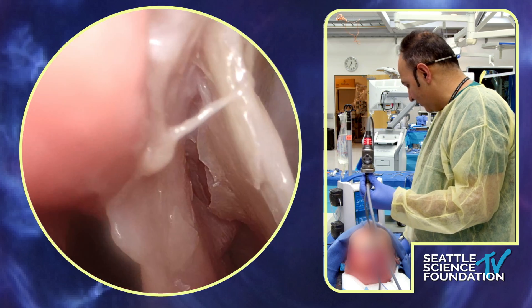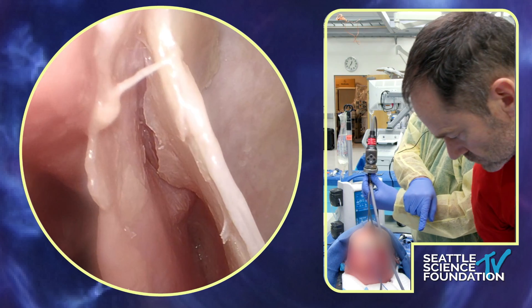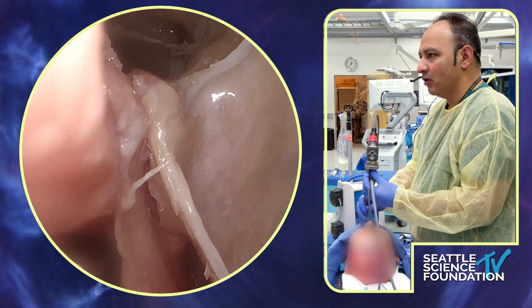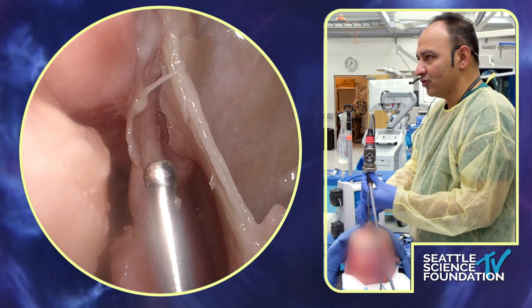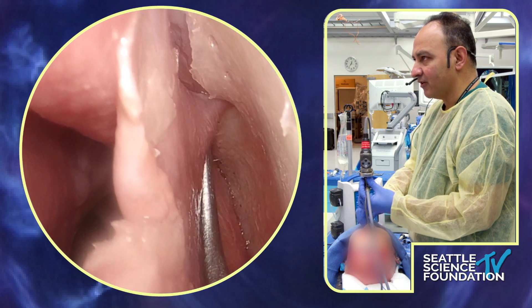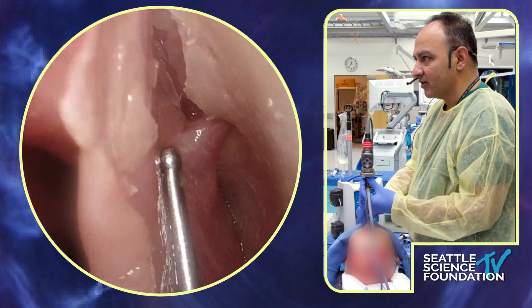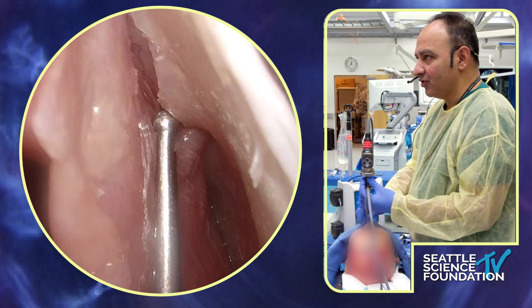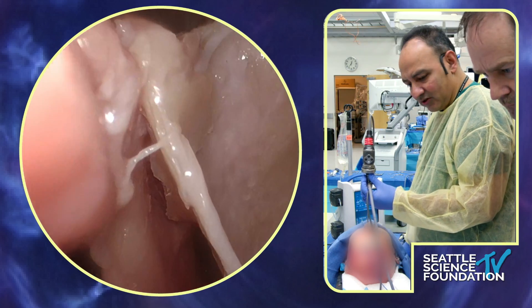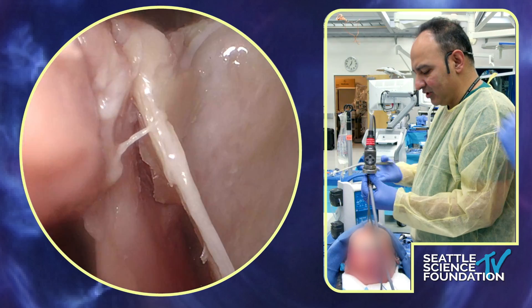If you want to use a clip, let me have a ball-tip seeker. I'd love the ball-tip seeker to tease away some of this soft tissue — it's a nice gentle device you can use to develop a plane circumferentially around the artery. Some of you may have endoscopic clip access. And then you can also just take that off with a kerrison — let's get a one-millimeter kerrison. If we take that off, that should give us a very nice exposure.